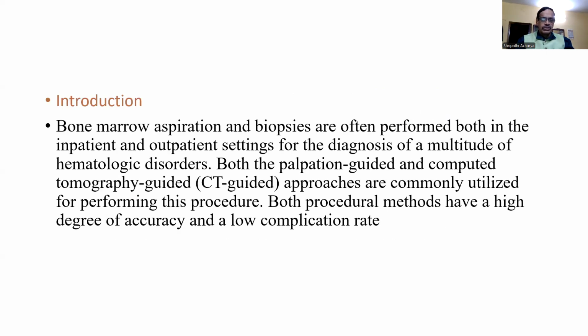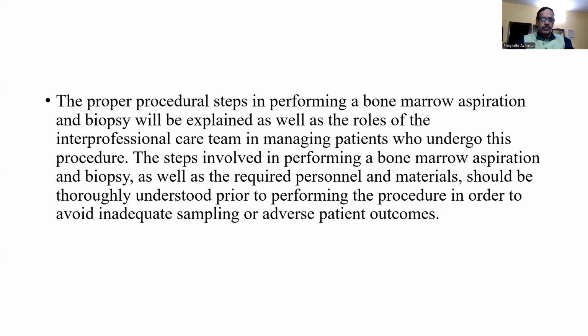Introduction. Bone marrow aspiration and biopsies are often performed both in the inpatient and outpatient settings for the diagnosis of a multitude of hematologic disorders. Both the palpation guided and computed tomography guided (CT guided) approaches are commonly utilized for performing this procedure. Both procedural methods have a high degree of accuracy and a low complication rate. The proper procedural steps in performing a bone marrow aspiration and biopsy will be explained as well as the roles of the interprofessional care team in managing patients who undergo this procedure.